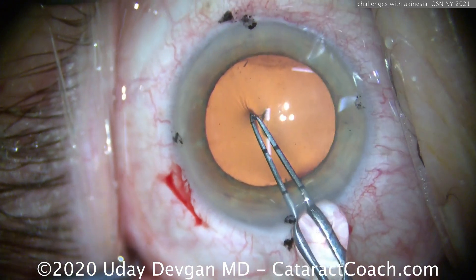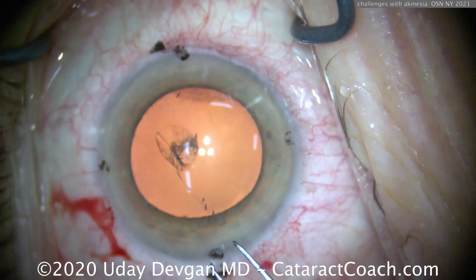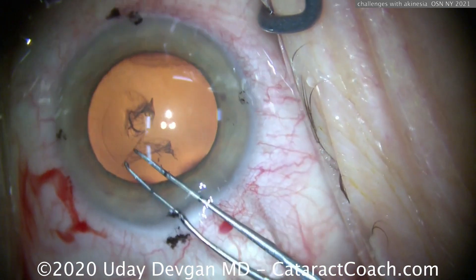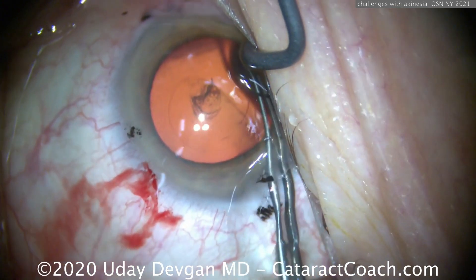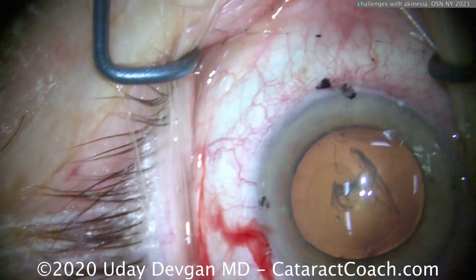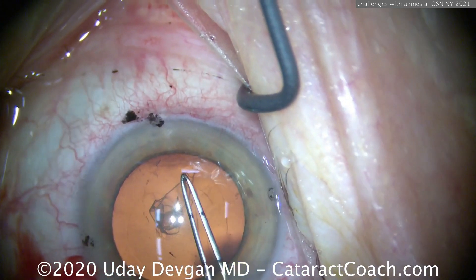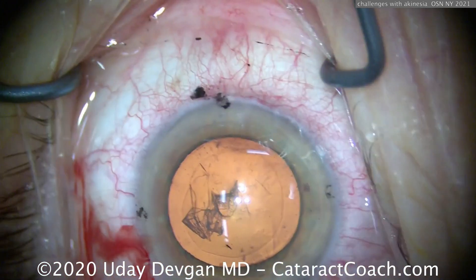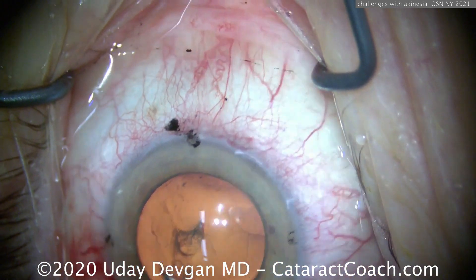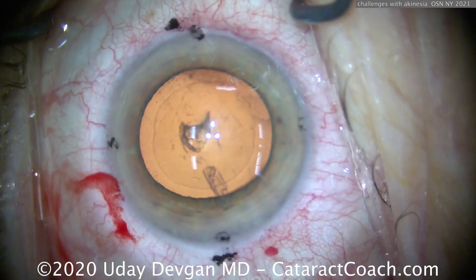We'll start the rhexis here. To prevent a run-out, any movement means you come out of the eye — your hands are resting on her face, and when you sense movement, come out. Then you'll have a few seconds of a window to do more surgery. There's another motion — let her get that out of her system. Now we'll have another 10 seconds of ability to operate. I feel sad for the patient, but she needs this surgery. You can see the toric alignment marks on the cornea. Let's get that rhexis done — a nice 5mm rhexis.